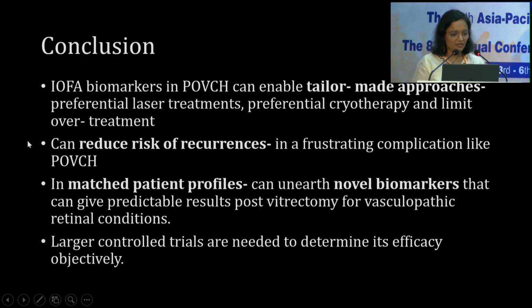It can potentially reduce the risk of recurrences, reduce over-treatment or under-treatment by allowing only IOFA-enabled treatment during a lavage. Larger studies are needed to determine its true efficacy in vitreous cavity lavage. Thank you.